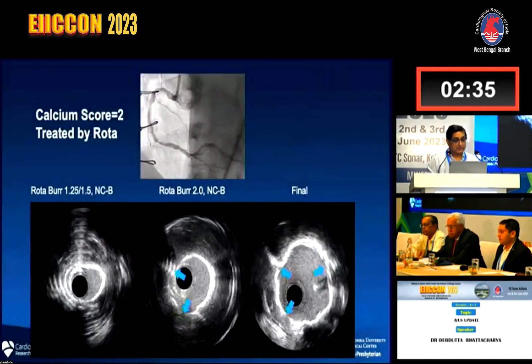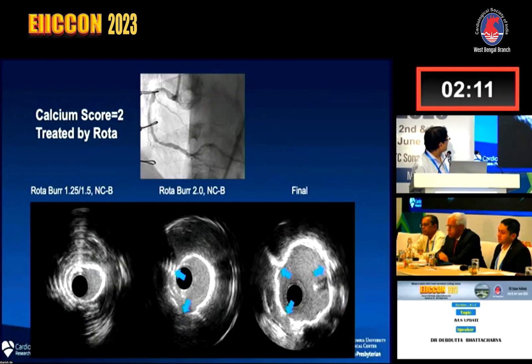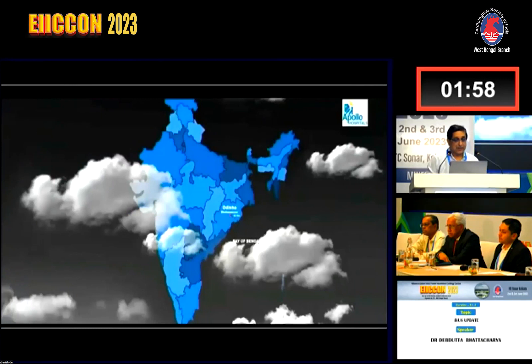This is an example of a patient with a calcific lesion. Two sizes of rotablator burr were used — 1.25, then 1.5 with a non-compliant balloon, then a 2.0 burr. After the rotablator, some calcium has been scraped off — you can now see reverberations — but the lumen was not large enough, so a 2 mm burr was used. The final result shows the stent is well expanded.